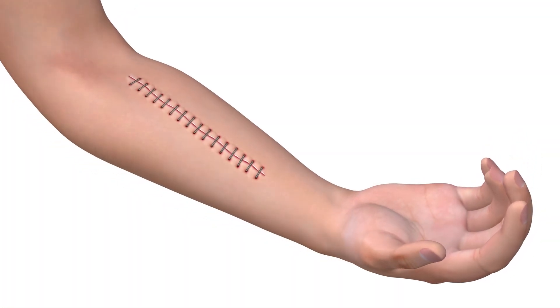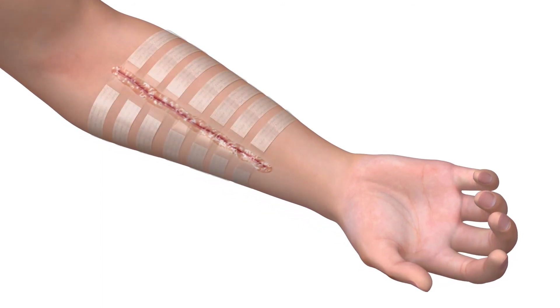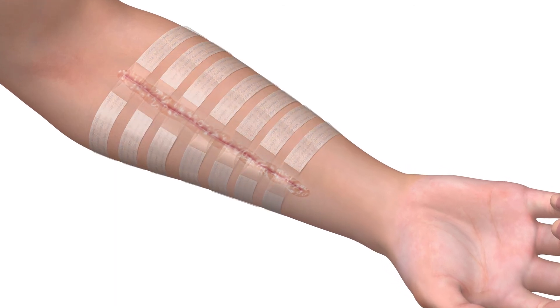Whether a wound is closed by staples, sutures, or glue, reinforcement by Suture-safe improves patient comfort, recovery time, and cosmetic results.